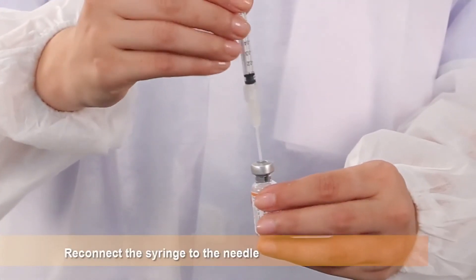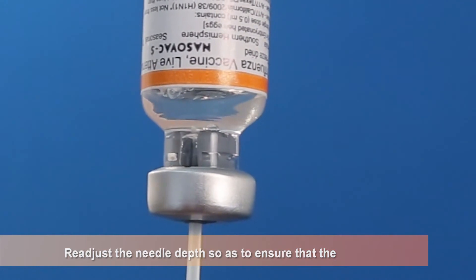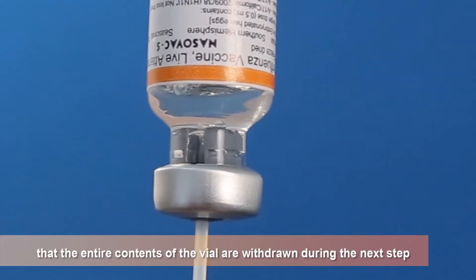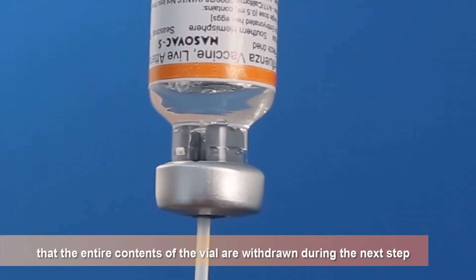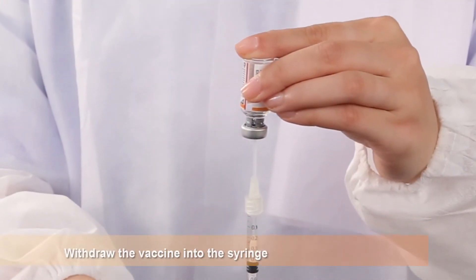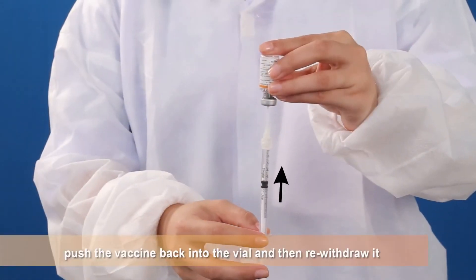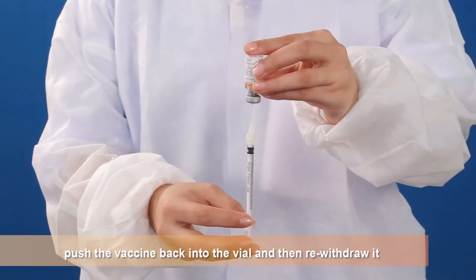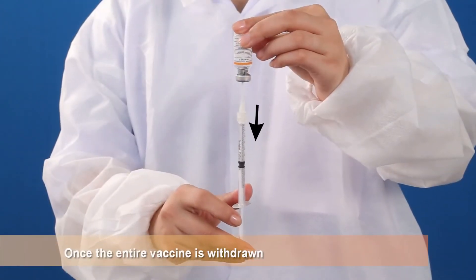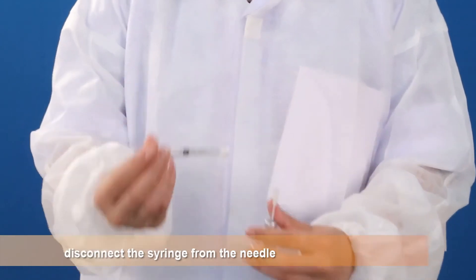Reconnect the syringe to the needle. Readjust the needle depth so as to ensure that the entire contents of the vial are withdrawn during the next step. Withdraw the vaccine into the syringe. If there is any air bubble in the beginning, push the vaccine back into the vial and then re-withdraw it. Once the entire vaccine is withdrawn, disconnect the syringe from the needle.